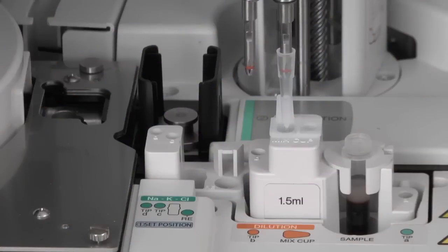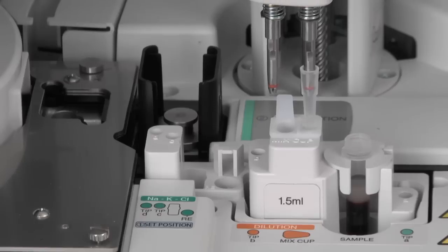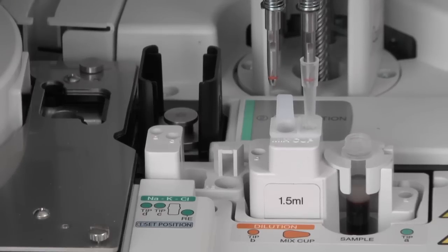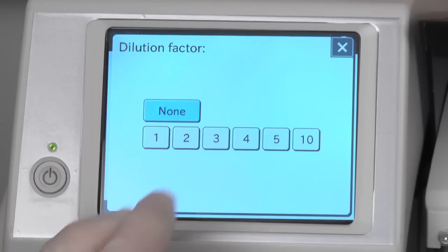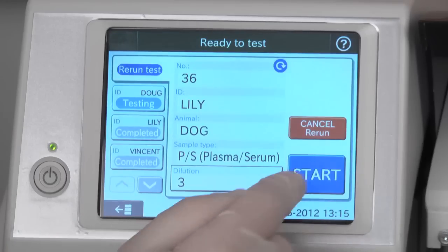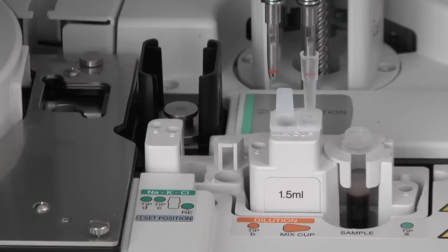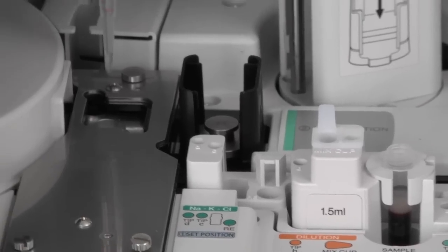For results that are outside of measurable limits, the Element DC offers automated sample dilution, which eliminates guesswork and time-consuming manual steps. Simply set your sample, choose your dilution factor, and the analyzer will automatically perform the dilution and calculate your results accurately and quickly.